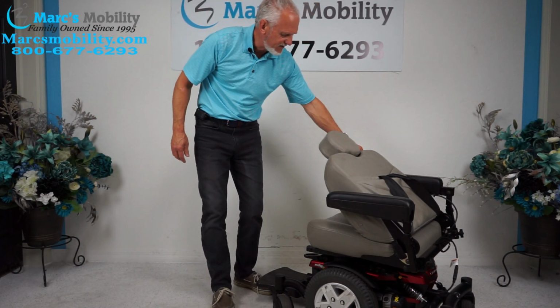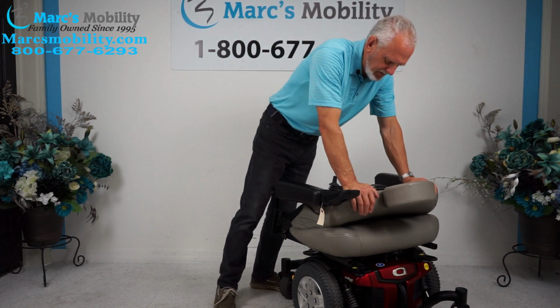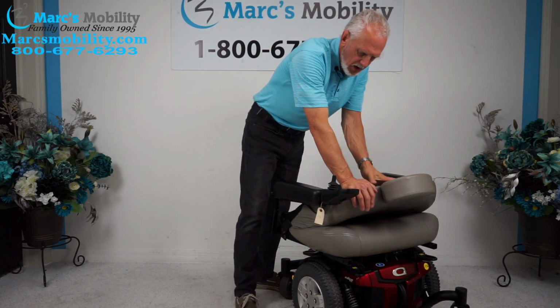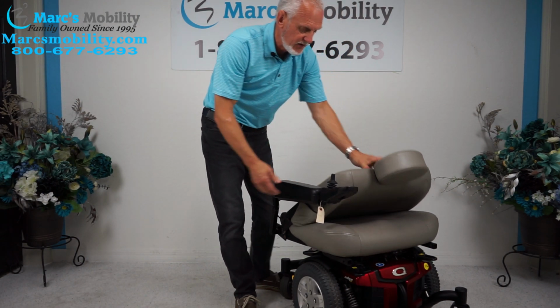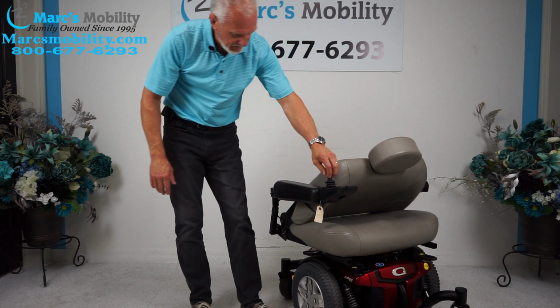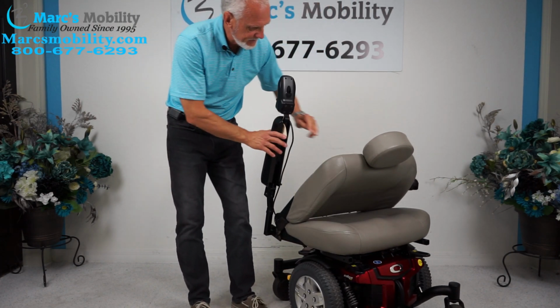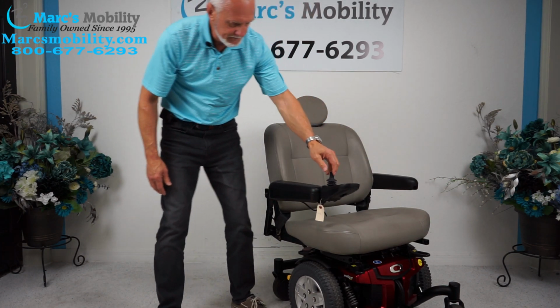This is a flip down seat, so this is as far as it'll flip down. If you push it, I guess it'll flip down more. Your total height without the headrest right here would be about 31 inches, okay? So you'd have to push this down to get to 31 inches. The arms do flip up on the chair. The joystick's on the right. It can go on the left with no problem.